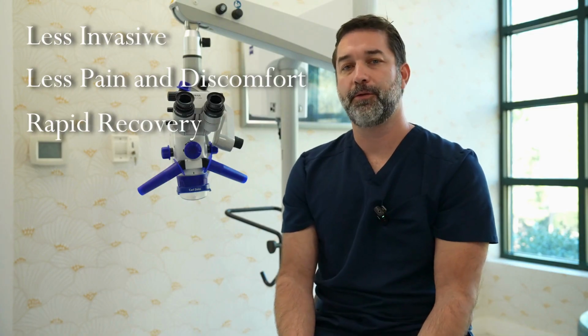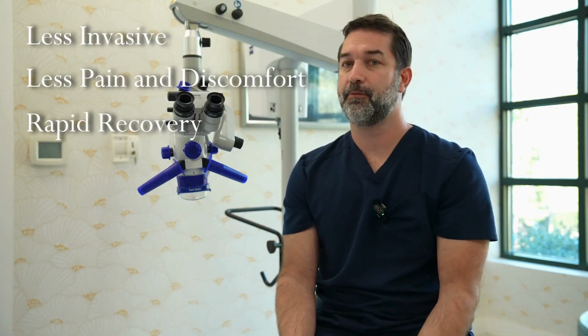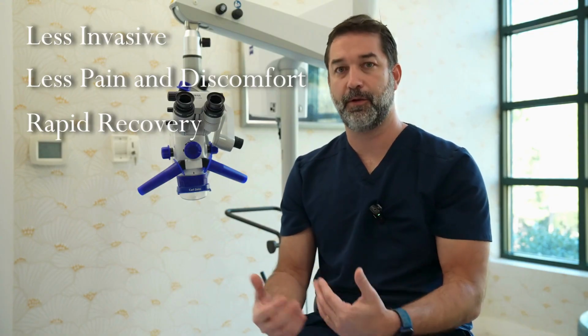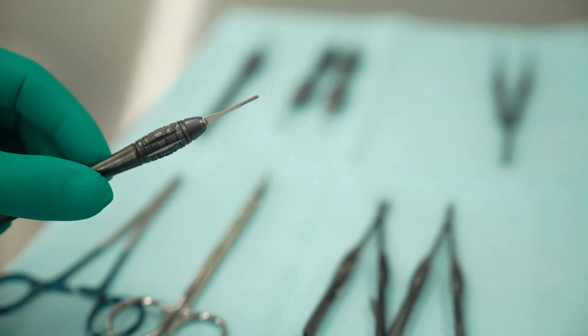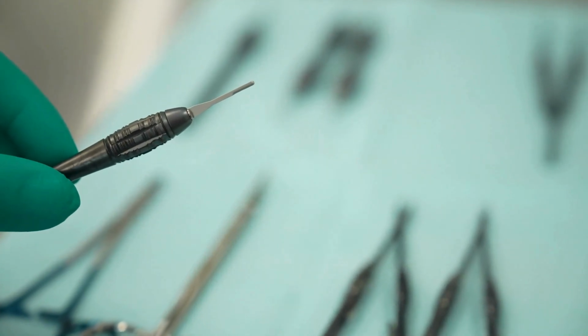To perform periodontal microsurgery, it's not just my skills and the microscope that are required. We also need a special set of instruments that will allow me to use the microscope and the magnification, which can be up to 20 times bigger than what my eyes can see. That includes different forceps, different blades, and also the suture material.